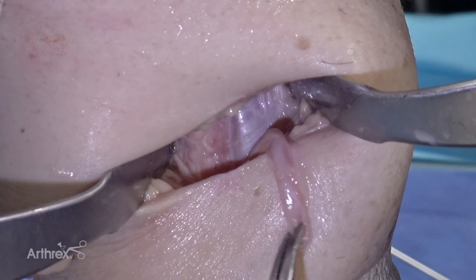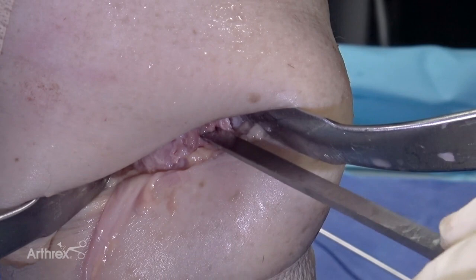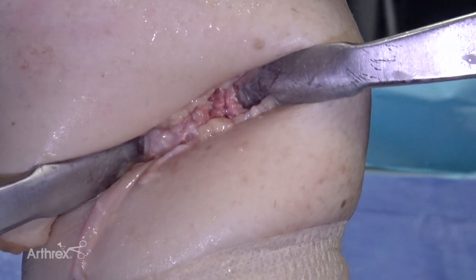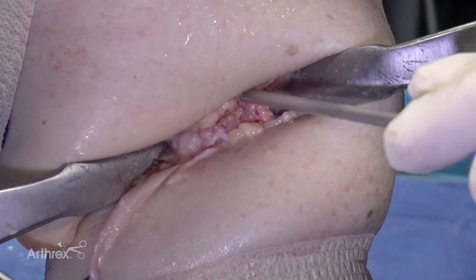So typically, we would prepare the proximal humerus of soft tissue in a footprint maybe 1 by 2 centimeters. Oftentimes what I'll do is I'll fish scale the humerus just to create some bleeding. You can also use your arthroscopic bone cutter open with irrigation just to denude the surface for preparation. Basically trying to create a biologic landing strip for healing. Another option for humeral preparation, what we designed is a serrated tip on the guide. It'll act to hold the guide onto the bony surface, but you could actually use it, instead of opening up a set of osteotomes, you can use it to prepare the proximal humerus.